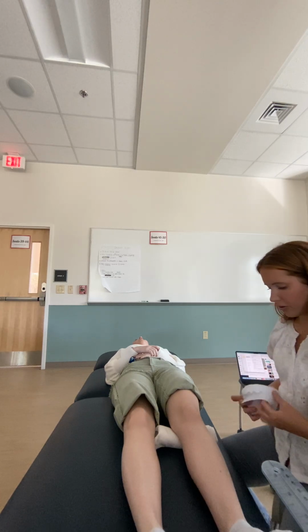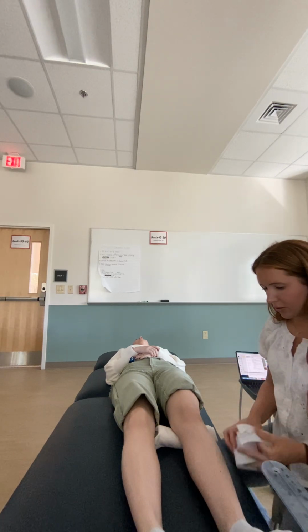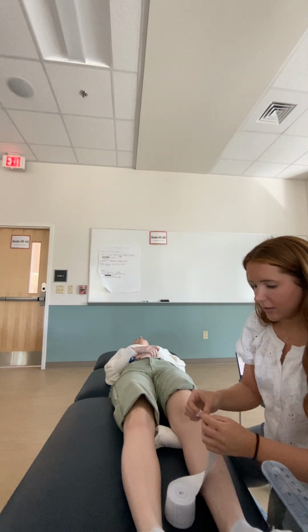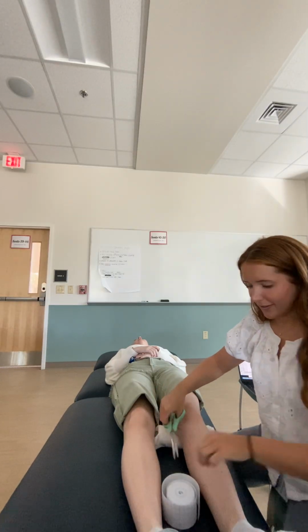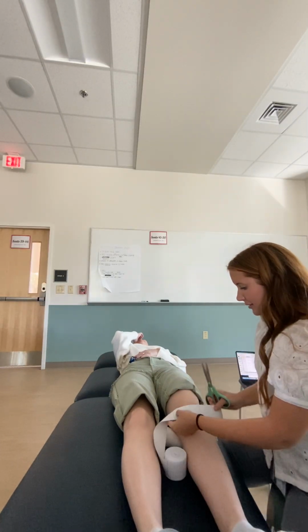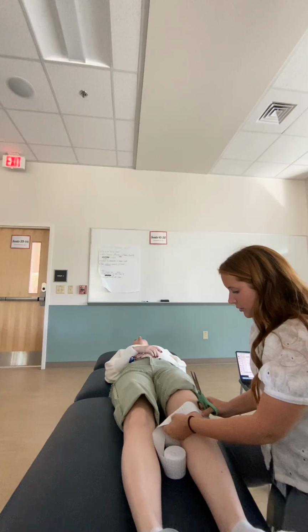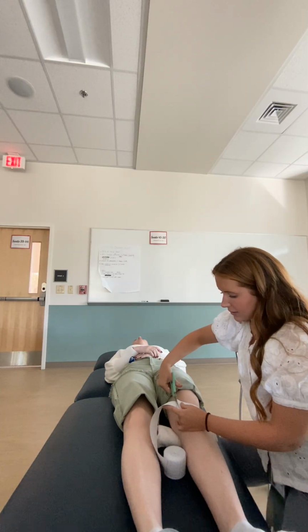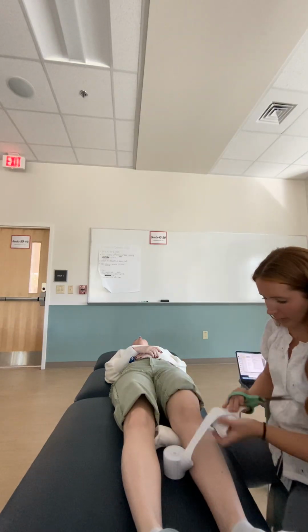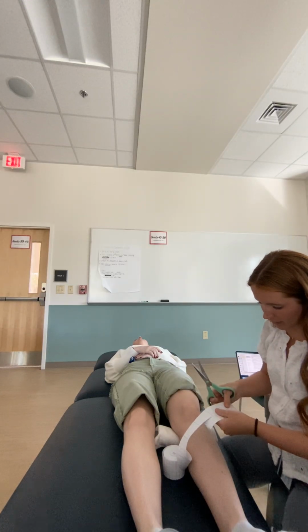Oh, I've got these terrible scissors here. Oh, actually, these are good. Just a little bit wider than the length of your kneecap. I'm gonna cut that. And then I'm gonna measure one more piece that width.